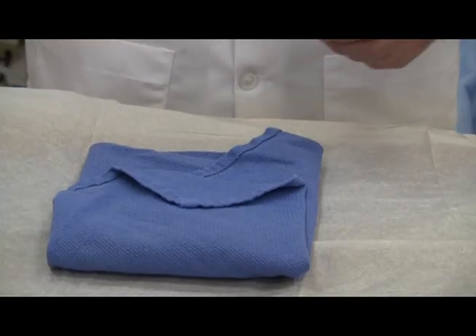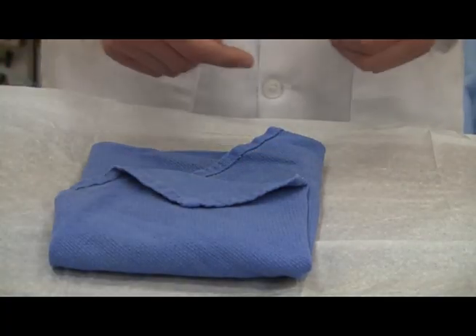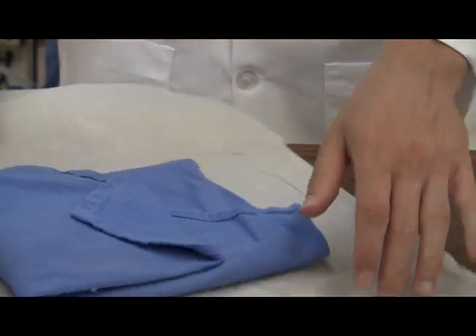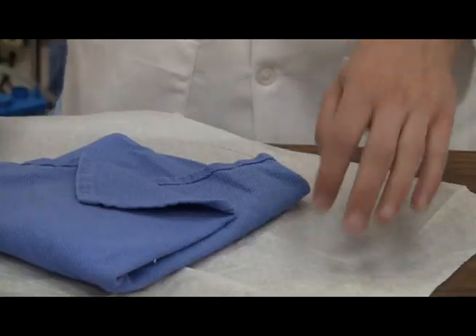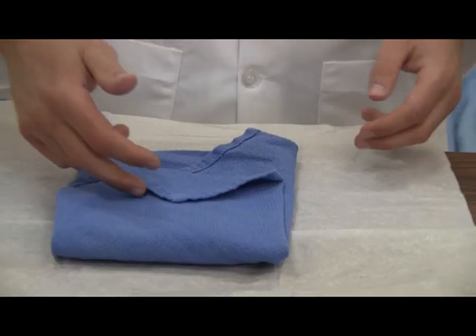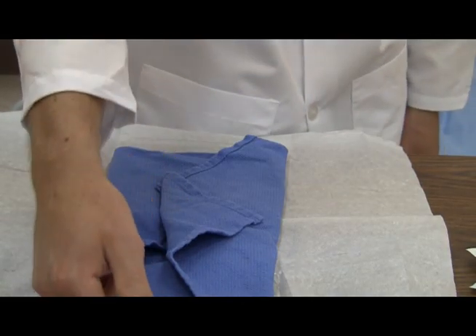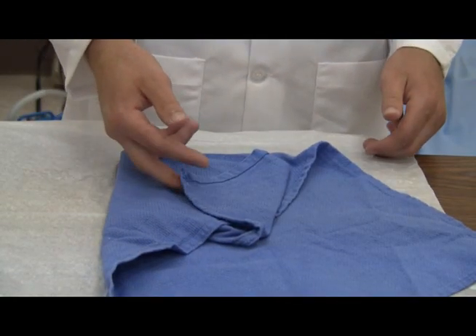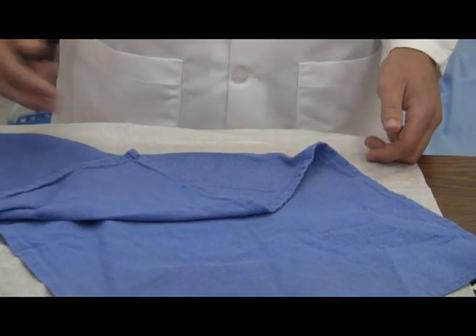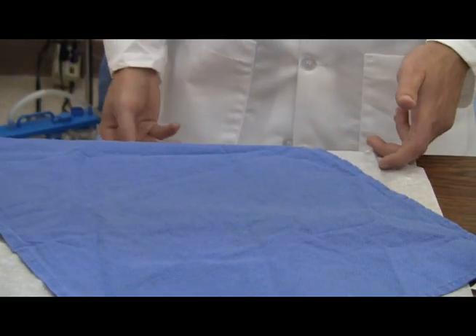So now that we have the towel in front of us, we want to make sure that we open away. This corner here is facing away, so it's going to open away from myself. If this corner was facing to the right, it would open to the right. So spin it so that the corner is facing away from yourself. Take your two fingers, put them under the crease. Two fingers under the crease. Two fingers under the crease. And finally, two fingers under the crease and pull towards yourself. And we've opened the towel.